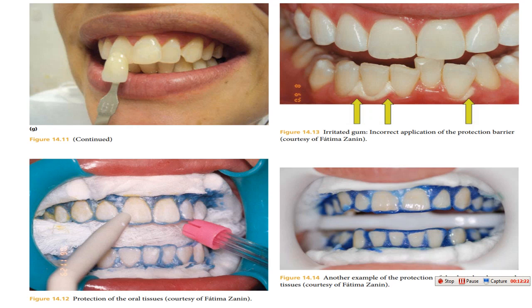At the end of this subject of bleaching, most problems of bleaching occur with reduced clinical experience. So it is important to reach a successful result. To reach a successful result, hands-on training and clinical experience with theoretical knowledge should all be followed to reach a successful bleaching process.